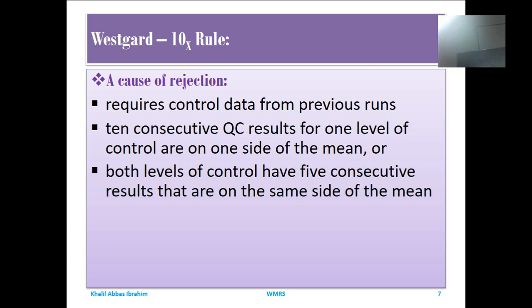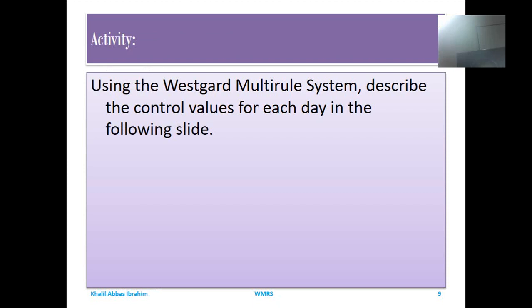Measurements should be rejected immediately, the situation analyzed and investigated, problems and the source of the problems pointed out, errors resolved, and after that the examination of patient samples resumes, and they are assessed for being correct and free from defects, and after that service is to be issued.